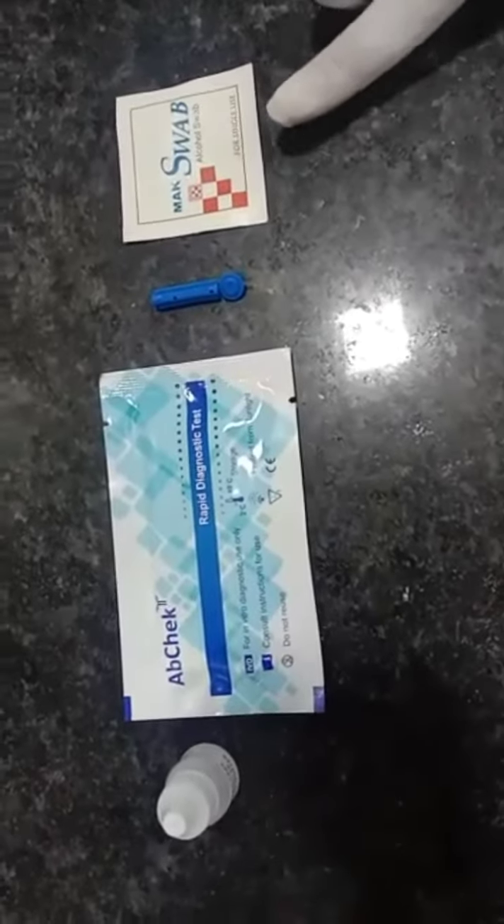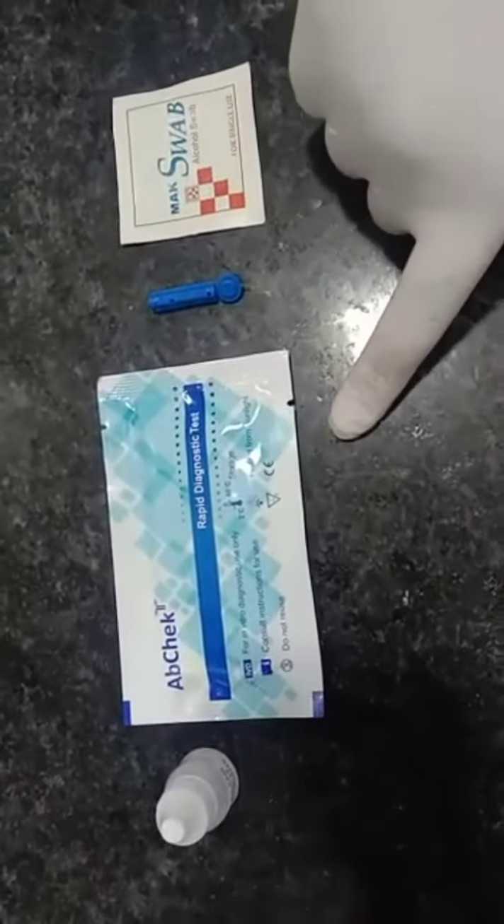This is the AbChek COVID-19 IgG/IgM antibody rapid test kit. We require an alcohol swab, one lancet, one cassette, and assay buffer.